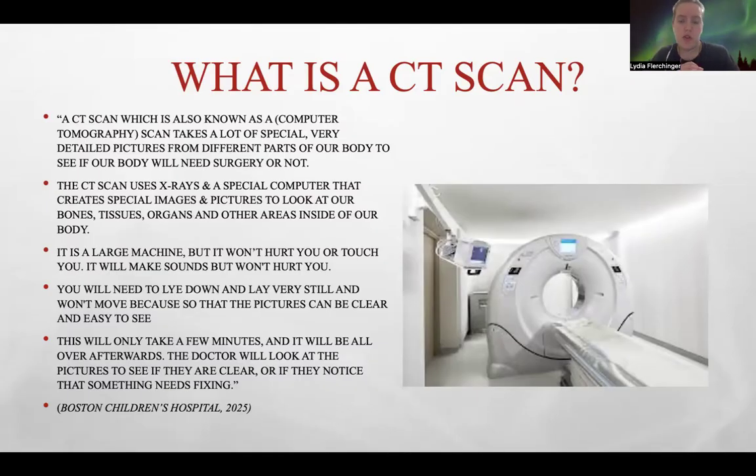So then the bed goes through the hole. It looks like a big donut. And it starts making noises, like it starts taking pictures. And it only lasts a few minutes.